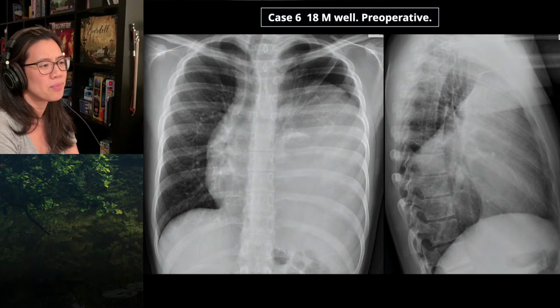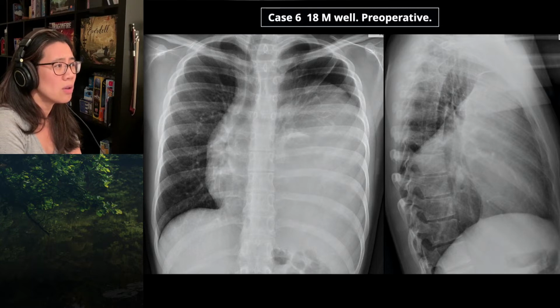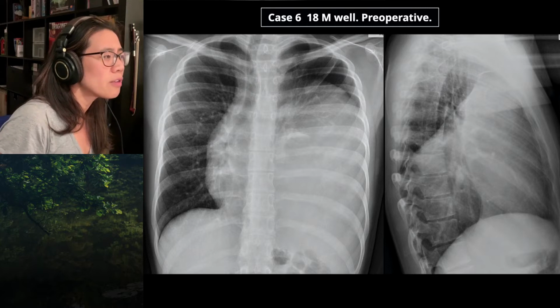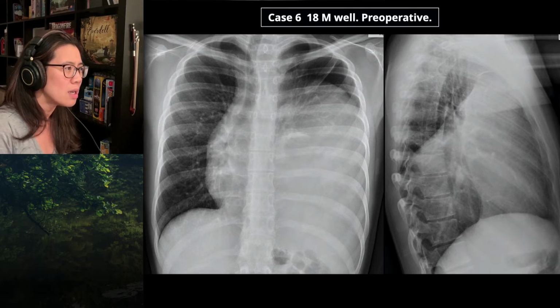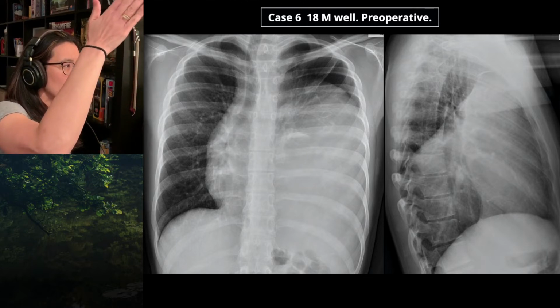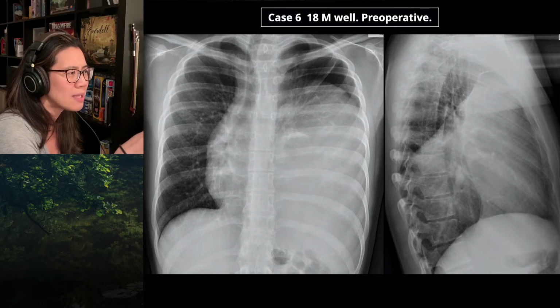Chest wall. Yep. Now, you said the mediastinum was displaced to the right. Yep. What about the trachea? The trachea is displaced to the right too, which is weird. All of it. Initially when you asked the question, the first thing I did was look at the rotation of the film because I thought you were trying to lead me to the fact that maybe the mediastinum isn't displaced. But it's a well-centered chest x-ray on the frontal. So the whole trachea from the superior portion to its bifurcation is displaced, which is weird because it doesn't correlate to where the opacity is.